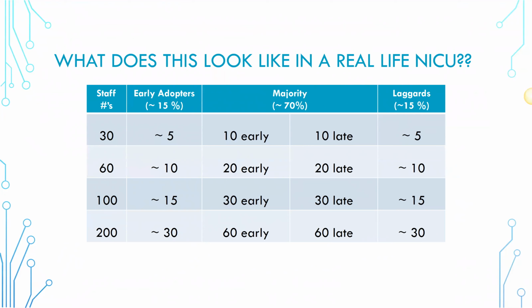And we realized it was about 1/3 of our patients that we would have admitted to the neuro-NICU. And then at least half of those we would have monitored. So it helped us gauge the scope of our program, and it also helped us gauge how many devices we needed to buy.